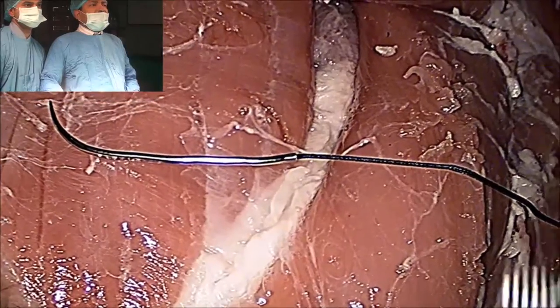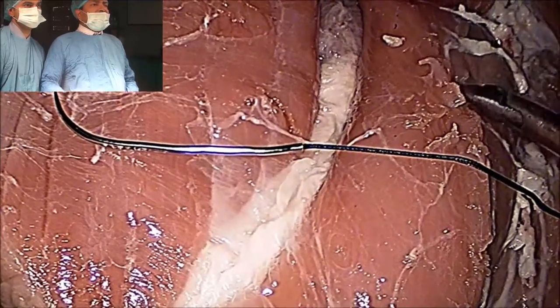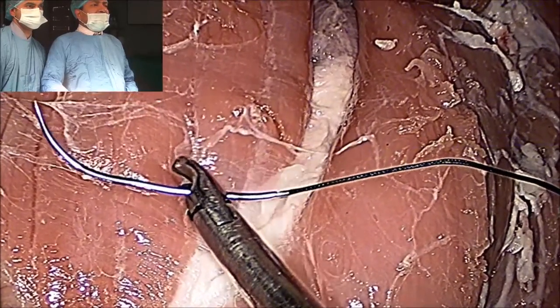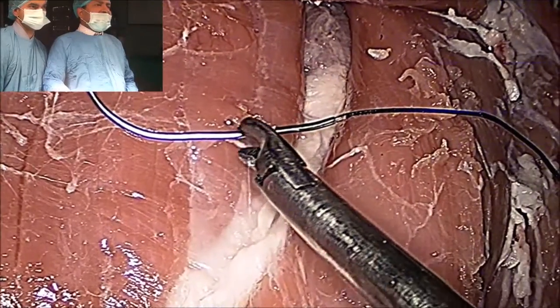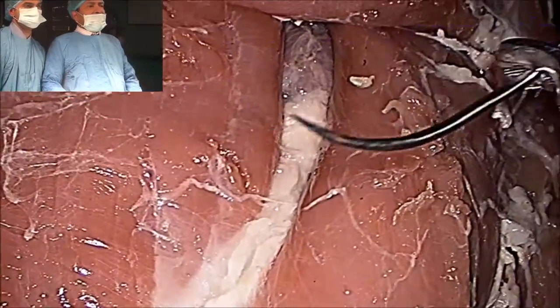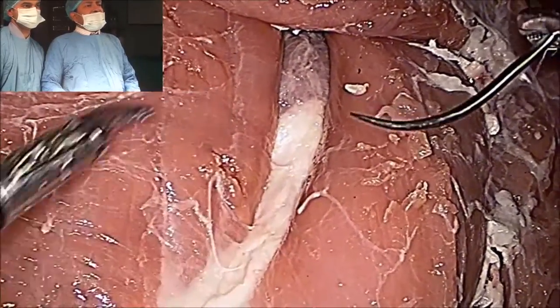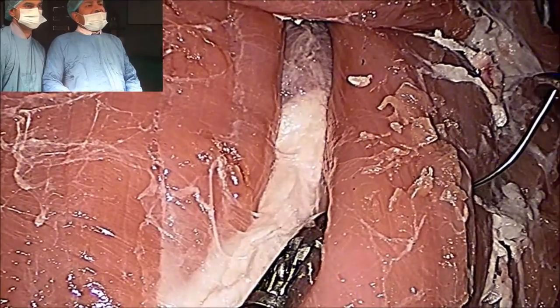After that you will go with the partially open jaw and touch it by the upper jaw — automatically it will become erect up. Again, you have to go with the partially open jaw and press it up, it will erect up. Suppose this is myomectomy, suppose this is a tissue which is under the gap.